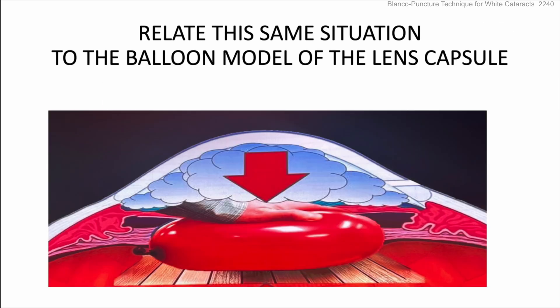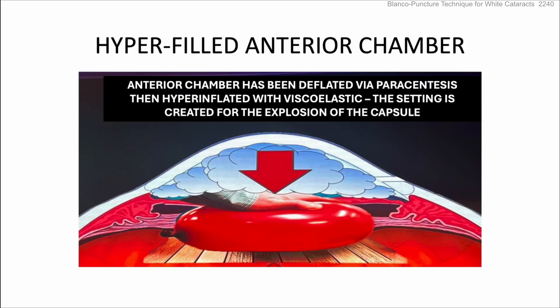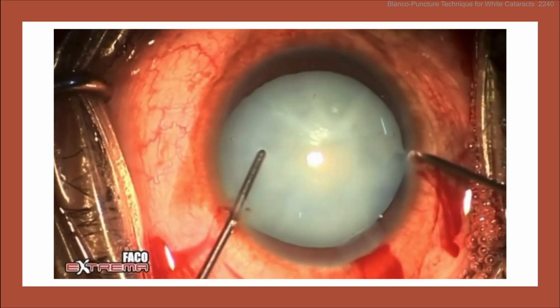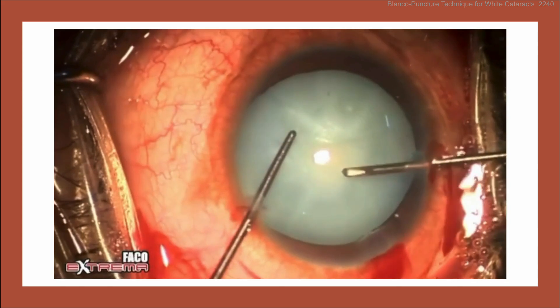The same balloon situation applies — if you push down with too much force, you're more likely to rip it. The standard approach is to deflate the anterior chamber with a paracentesis and then hyperinflate with viscoelastic, but that can be an issue. His idea here is to go inside instead and just do a puncture.